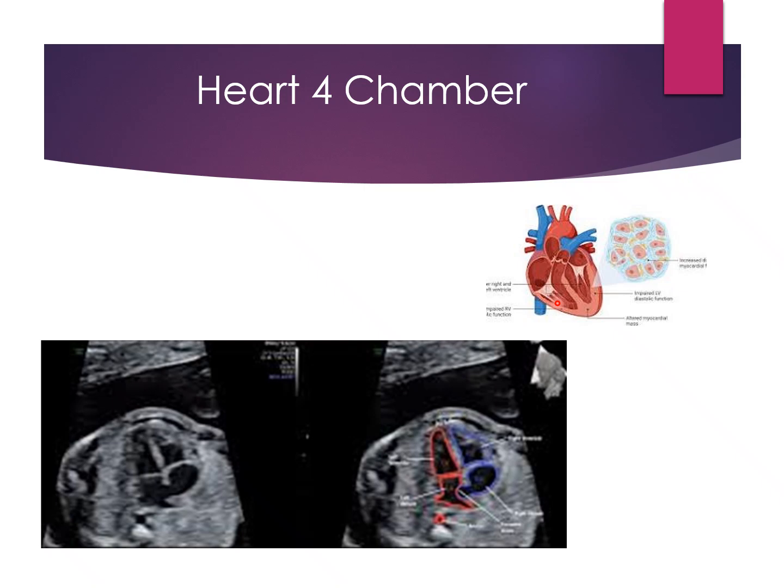If you find a ventricle or a part of the heart, just know that turning and twisting your probe will elongate that heart, and you'll be able to see the apex and the 4 chambers. You have the right ventricle, right atrium, left ventricle. Knowing all of those will really help, based on how that baby is lying in there, in order for you to get this beautiful 4-chamber heart.